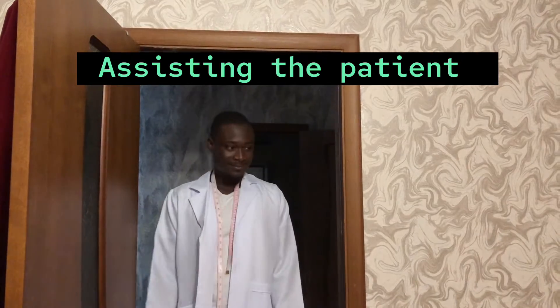In the next shot we are going to show how to assist patients to put on their compression stockings or their compression hosiery. Coming.